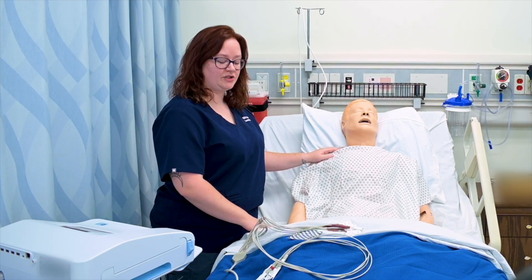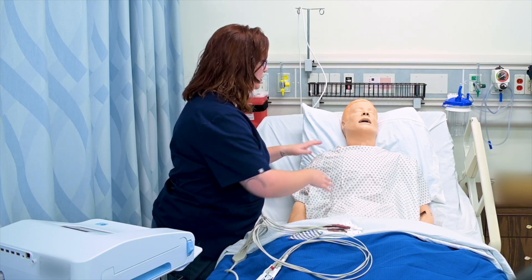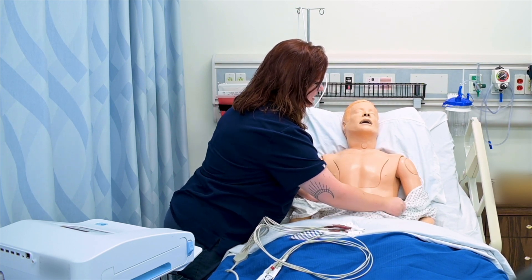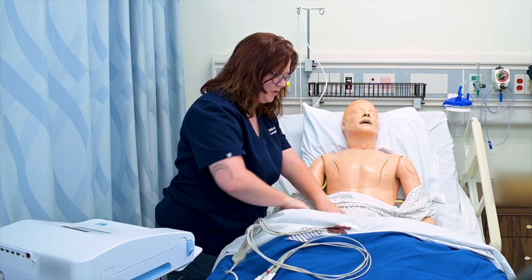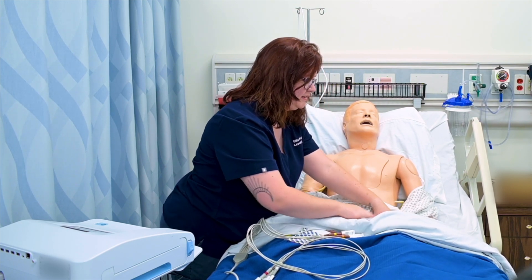Placing the electrodes onto my patient's chest is pretty straightforward. First, I'm going to ask him if I can expose his chest — I'll say, if you don't mind, I'm going to pull your gown down temporarily. We're going to need to see at least to about here. We'll also need to pull up his gown a bit to put our lower leads, so I usually just pull it up from the bottom like this.